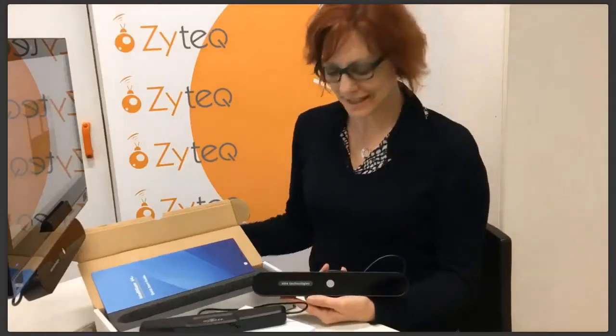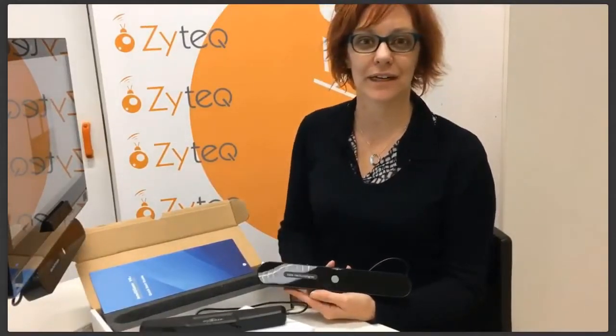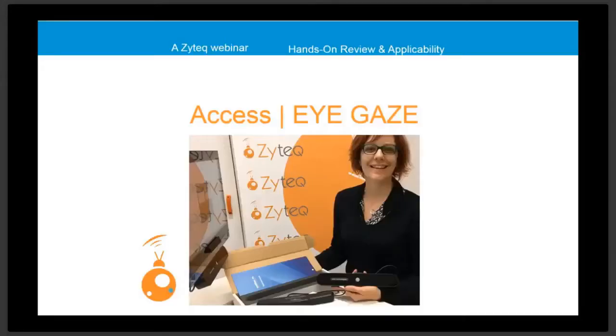These are eye gaze cameras. We have the Alea Technologies IntelliGaze camera and the Visual Interaction MyGaze camera. Both of these cameras can be used to control your computer just by looking at the screen. This webinar is a hands-on review about the eye gaze cameras available from Zyteq.